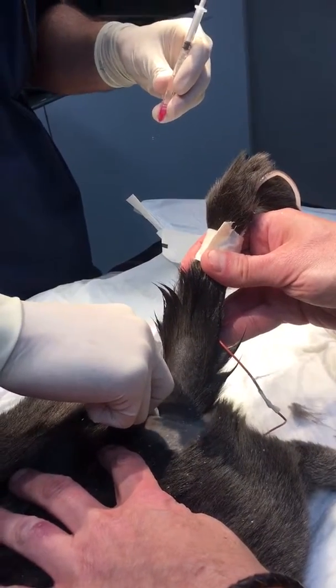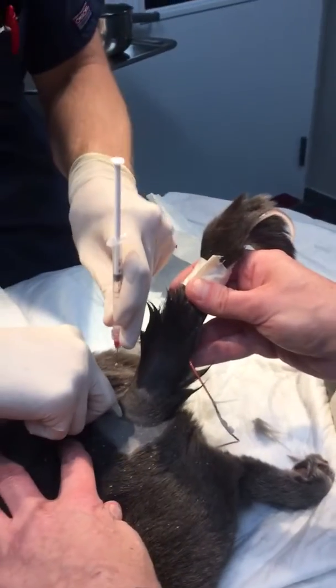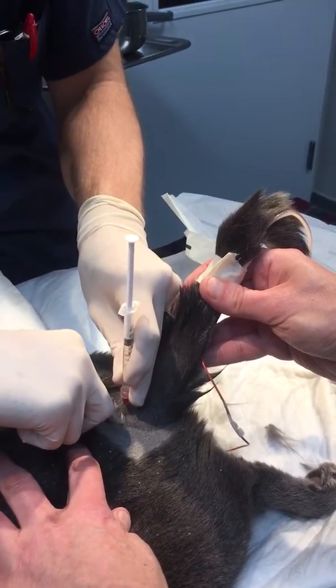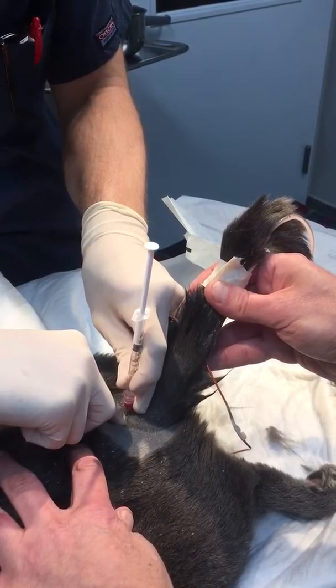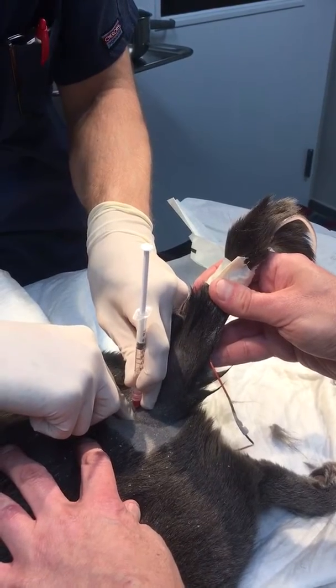Okay, I feel it. Very deep. So you're going to go in on midline. Straight down?